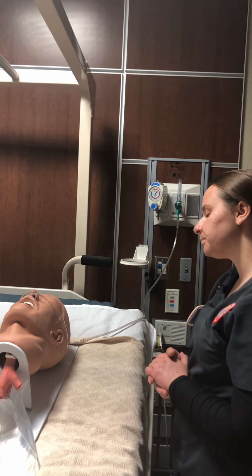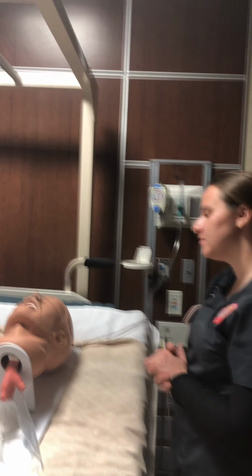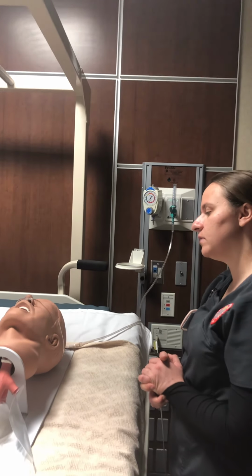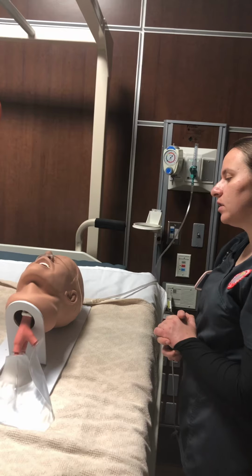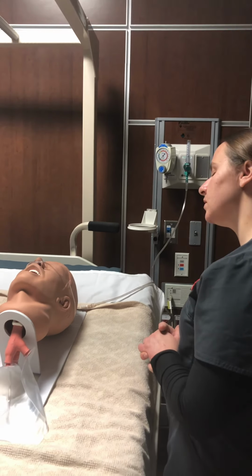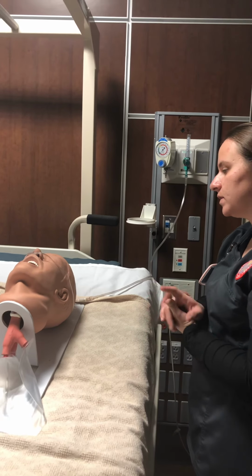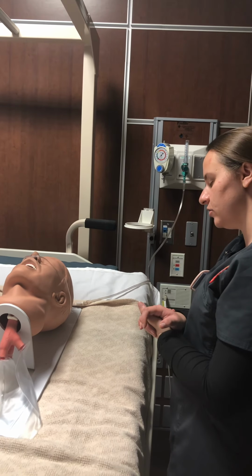Also, if you notice any dryness, especially where it's at a higher flow, I can add on a humidifier, just that way it gives you the humidity, or I even can do a water soluble lubricant, but please don't put any Vaseline in the nose, as that can cause combustion with the oxygen.